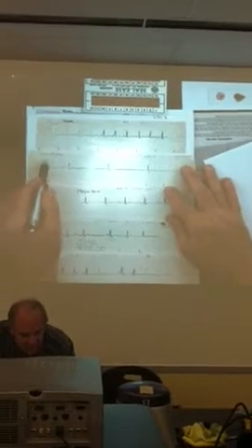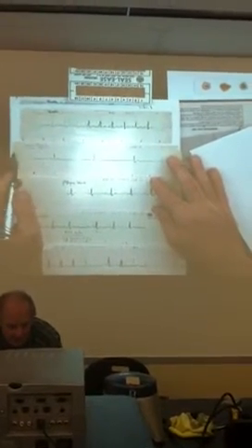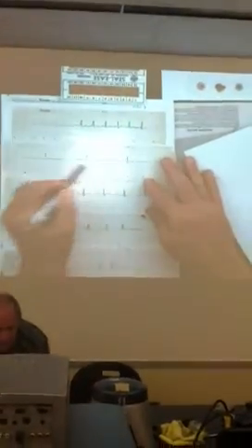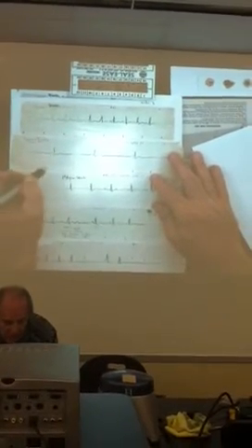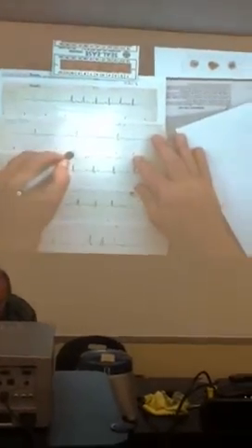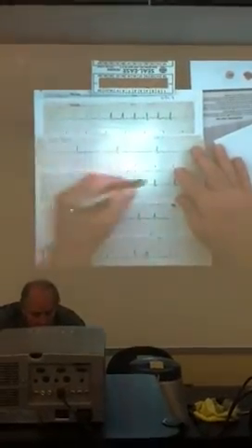All right, this says sinus bradycardia. That'd be like Lance Armstrong. Sinus brady. All right, so I got 1, 2, 3. The heart rate is what? 30. Heart rate there is 30. I'd have the seconds marked off for me. I have that done. 1, 2, 3, 4, 5, 6.